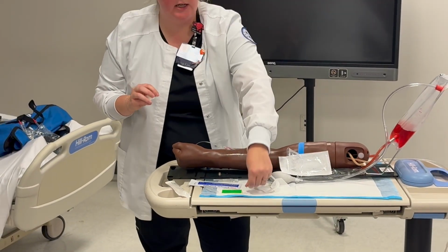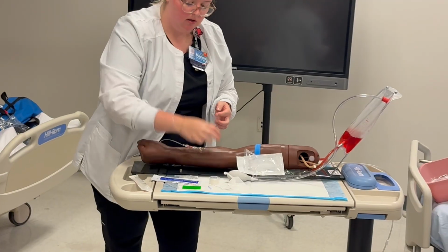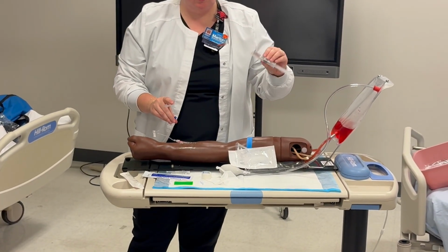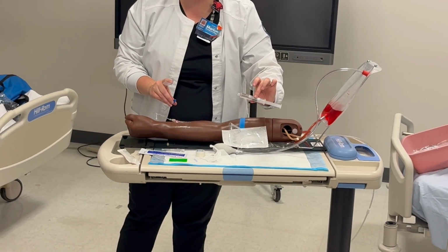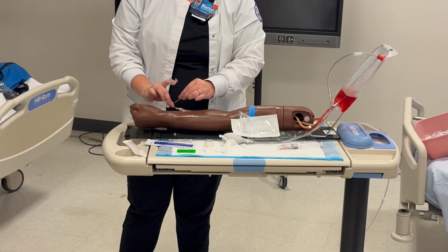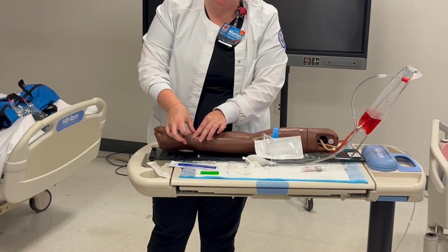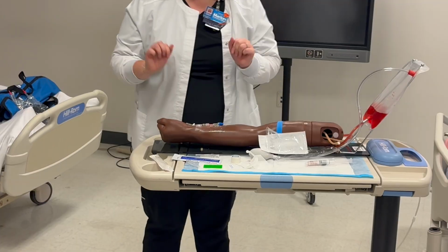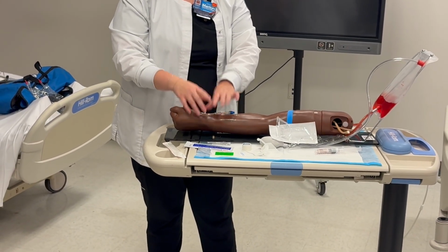Don't put this part on your patient. Rip that off. You can be done with your flush for now. In real life, you would throw this away. We will reuse it though when we do the other part of the skill. You want to tape this in a dependent position that keeps it out of the way of the patient and making sure that your lock can flow free, okay? So if the doctor said just put in an IV so that we have access, you'd stop here.